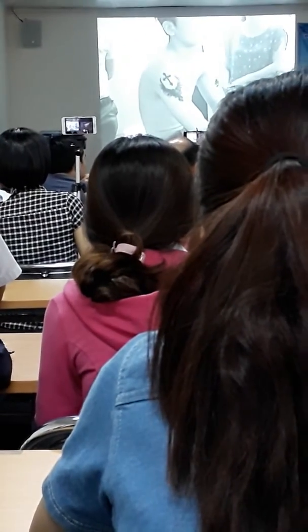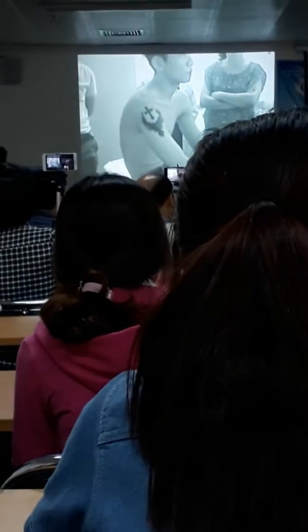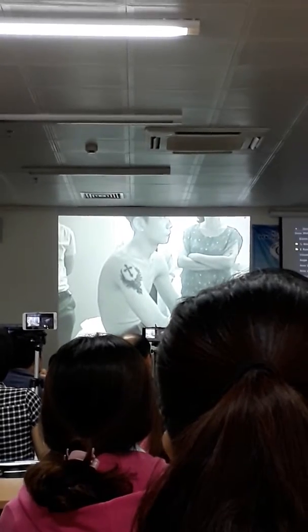So I ask them to move their arm, and so I can assess myself if there's any restriction or pain with movement. I will ask the patient where they have restricted movement or pain so that we can check that symptom.